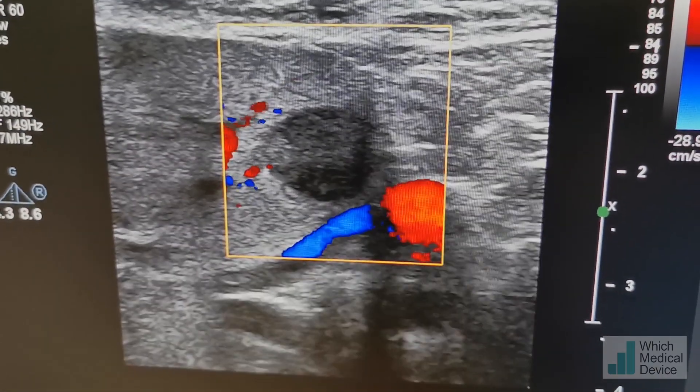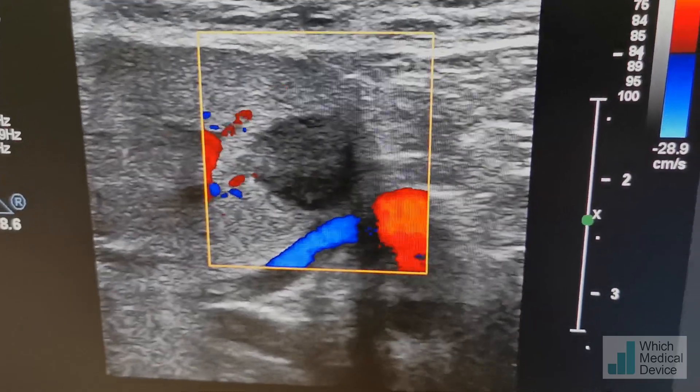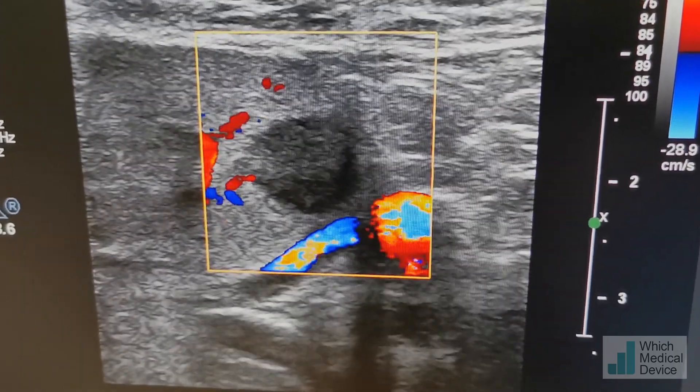Here we can see it on the linear probe and you can see the vessel right next to it quite nicely. We may actually do the ablation using the linear probe.